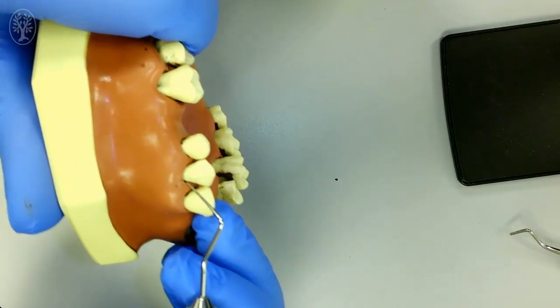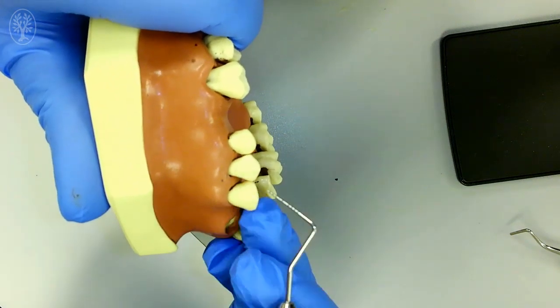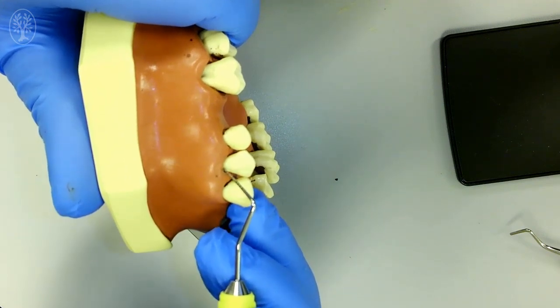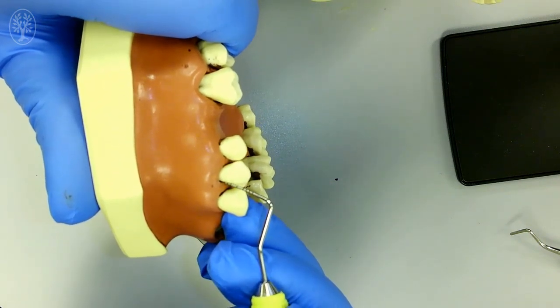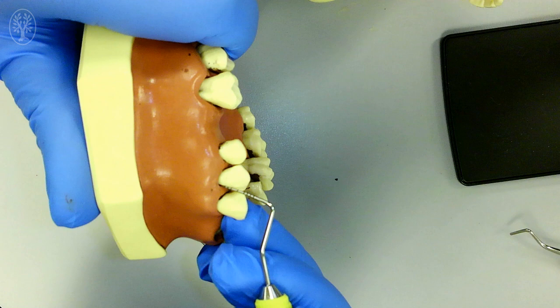Now, what if the cement-enamel junction is not visible? Here, the first task is to feel for the cement-enamel junction. The cement-enamel junction should feel as a linear feature that encircles the tooth, usually the point where smooth enamel ends and rougher root surface begins. Usually, there is also a step down with the probe as the probe slides off the enamel onto the more constricted root surface when inserting the probe apically. So here, the cement-enamel junction is 1 mm into the sulcus.